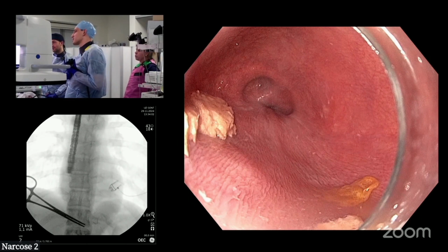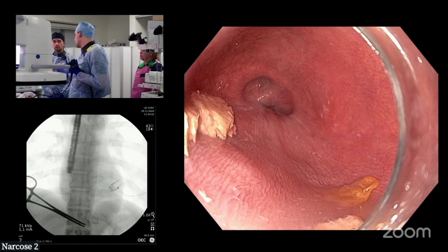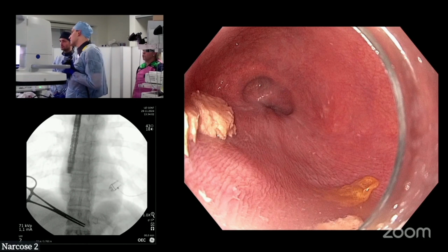We have also some food here that, of course, is food stasis that is causing this chronic esophageal inflammation. And we have also dilation just before the LES. Yeah, we have food stasis, we have water fluid stasis, we have papier-mâché / wrinkled furrowed esophagus. We also, by the look of it, have a bit of a tight area around the LES.